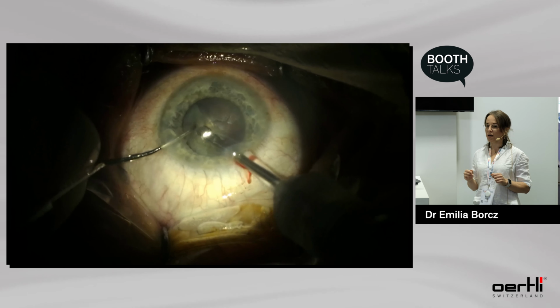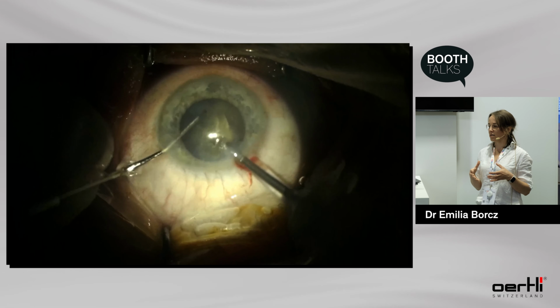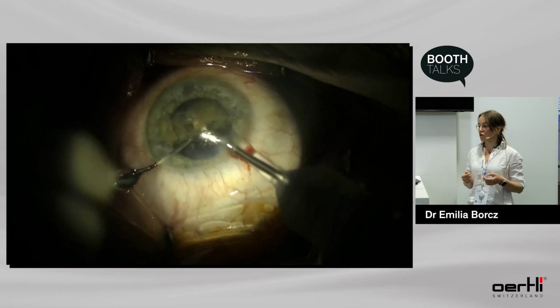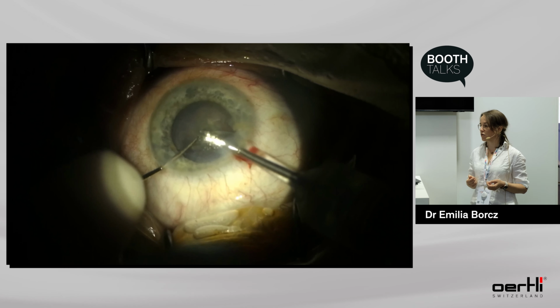But there is one situation that may happen: the anterior chamber collapses. If we perform too long a main incision, the sleeve will be squeezed and we will not give the possibility for fluid to enter the anterior chamber. So this is the only situation in which we can have a collapse of the anterior chamber.